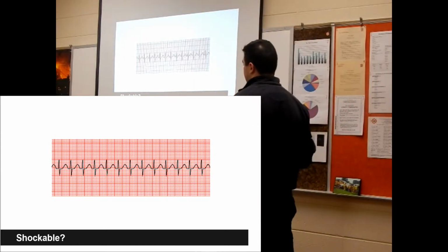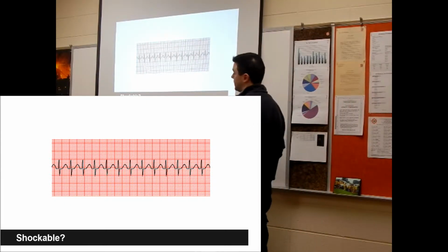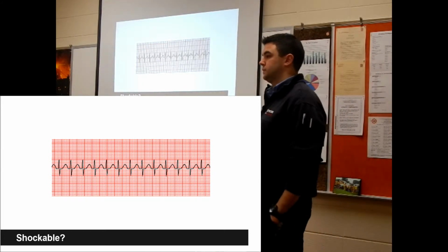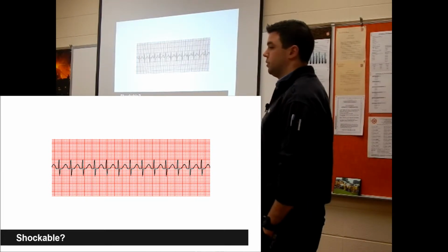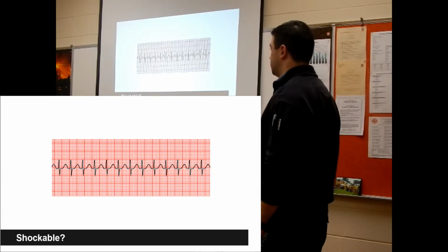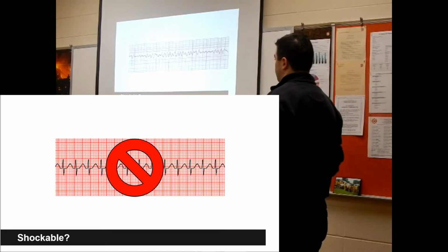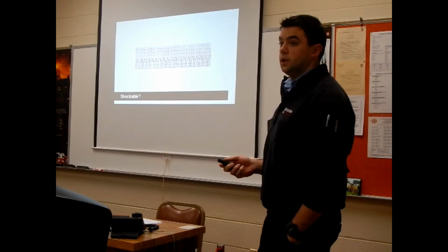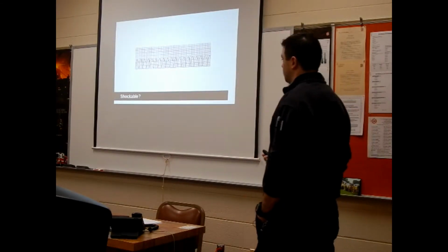What about this one? If they have no pulse and they're unresponsive, are we going to shock that? No? Okay. That's going to be your PEA, or pulseless electrical activity. And just to clarify, that last one, the VTAC, was pulseless as well. Yes. All of these are pulseless.